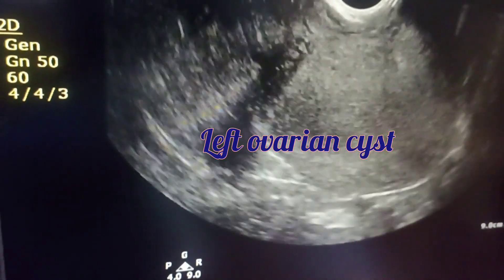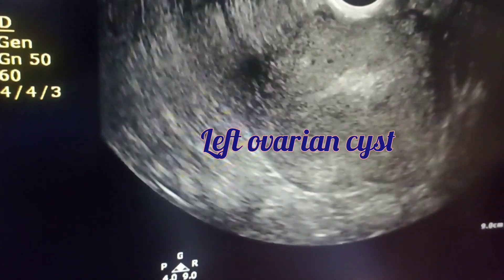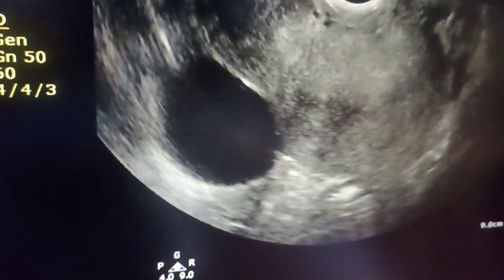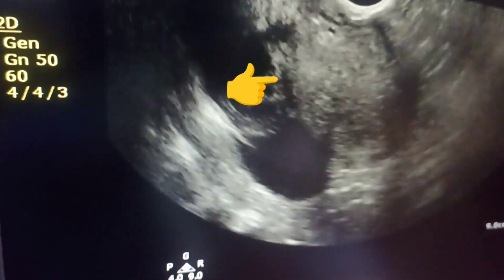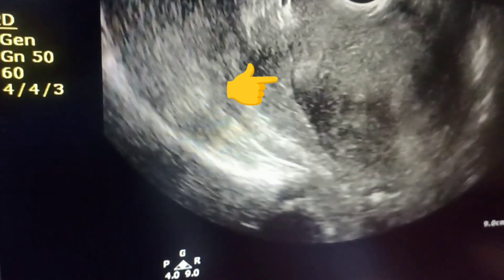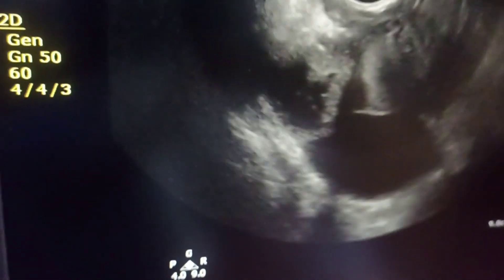This is a transvaginal scan in which you can see a bulky uterus, a left ovarian cyst, and the left ovary is adherent to the uterus. Also note there is a heteroechoic mass on the posterior uterine surface.